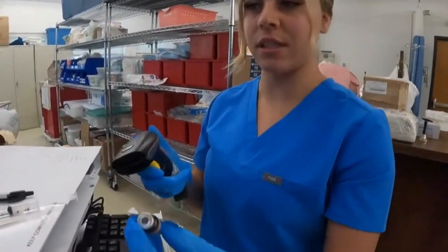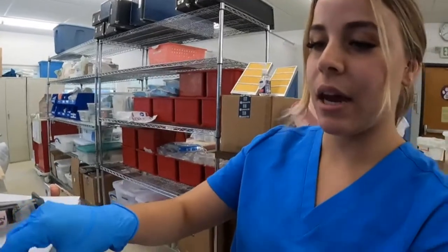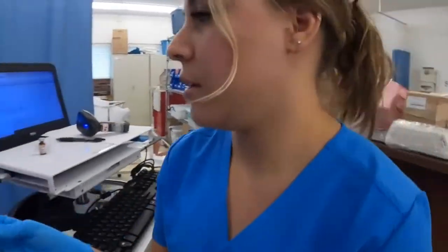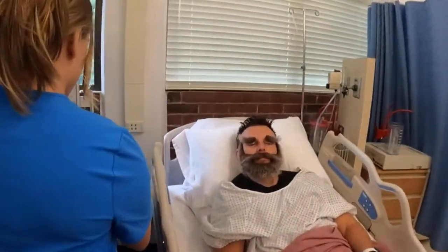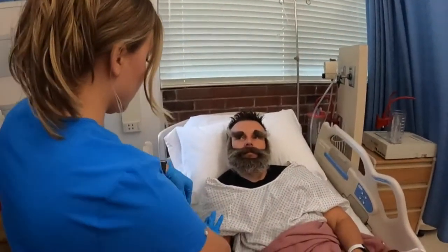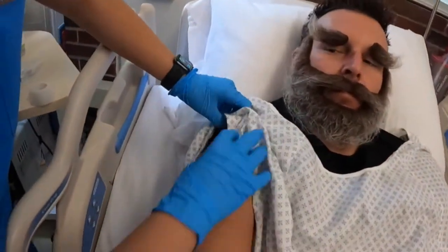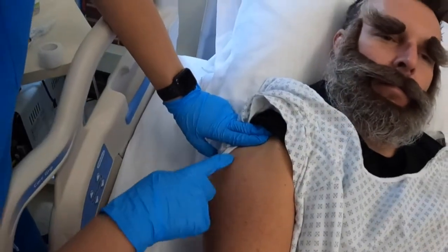I'll scan the medication since I've verified everything. That medication is scanned. Now I bring all my supplies to my patient at bedside. We have to verify the anatomical landmark for insertion — today I'm going to inject the morphine into the deltoid. I lift up the patient's sleeve: that's 2 fingers below the acromial process, so around here.